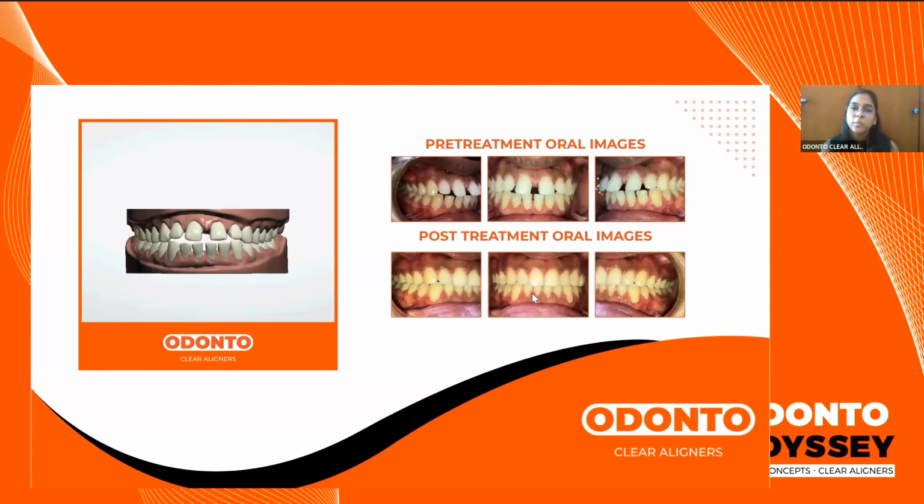If your premolar rotations are approximately 90 degrees or so, or even 180 degrees of rotation, then these are the kind of rotations which are not entirely possible with aligners alone. We can program those, but we do not give a guarantee as to how they will track. Those come into the moderate to severe category rotations. And if the posterior bite is not affected in that, as in there are no high contacts, then in such cases we do not carry out derotations of these premolars. We leave them as they are.